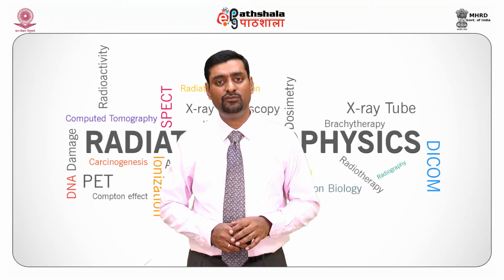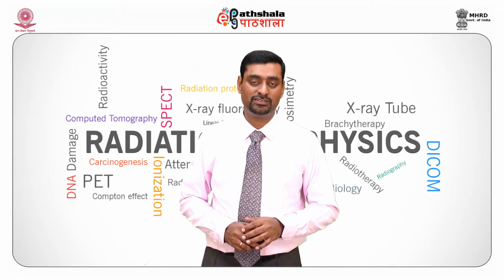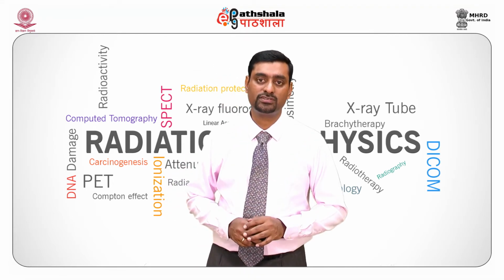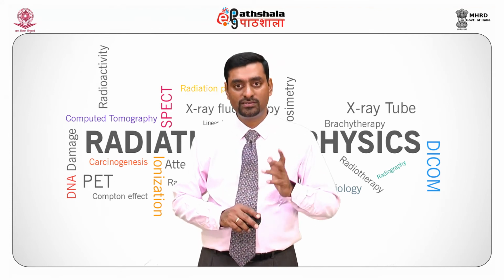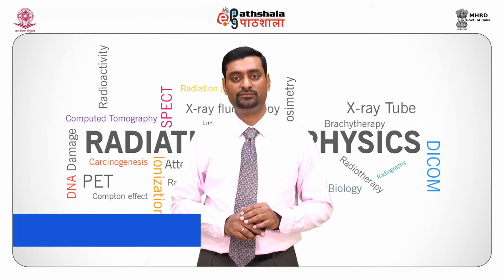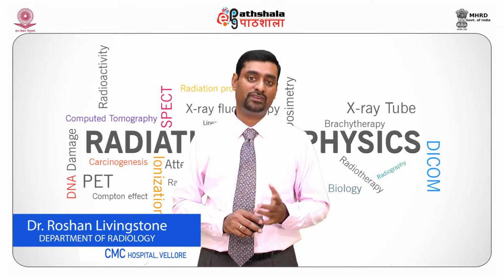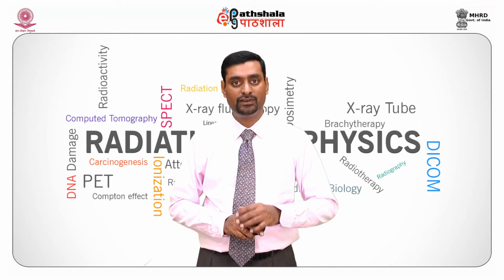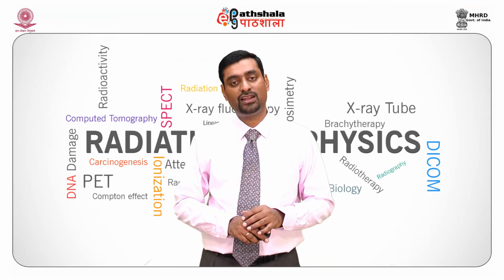Here, the invisible latent image is converted into a visible image. Now, we need to understand this. The entire processing takes place in a dark environment. Once the films are exposed to radiation, that is, they are contained into a light tight box as we saw earlier, they are transported by a radiographer into a dark room. There are various types of dark rooms.